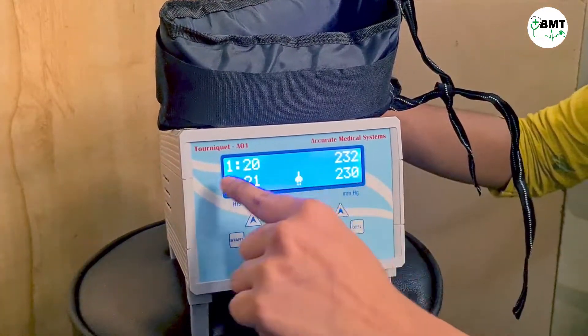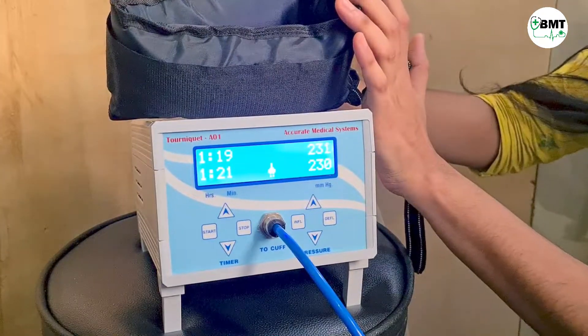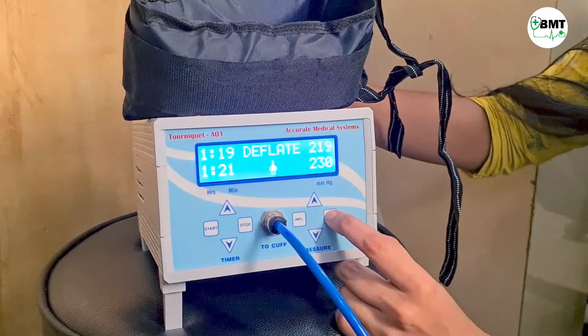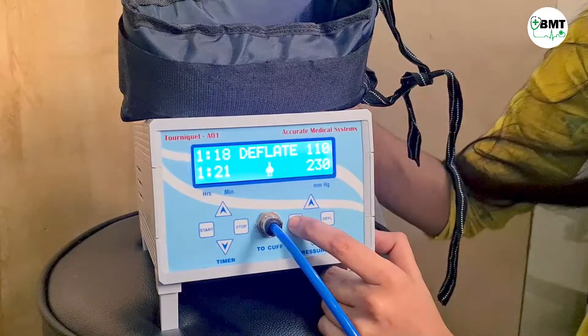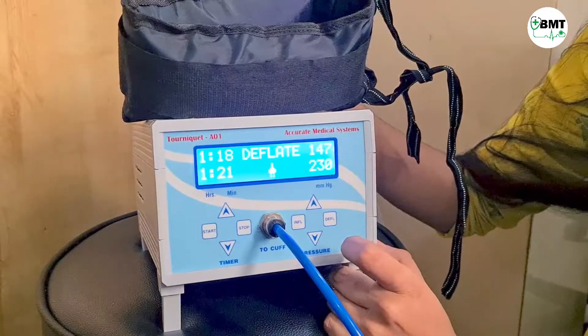Once the timer reaches zero, the cuff will start deflating automatically. If in between you want to deflate the cuff manually, you can do so. While inflating, if you press deflate in between, it will stop at that point itself.